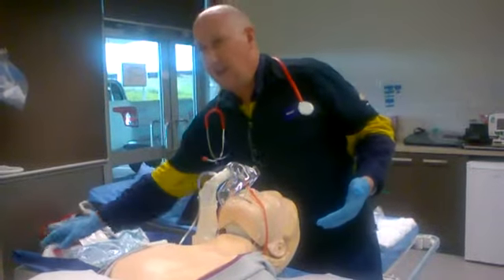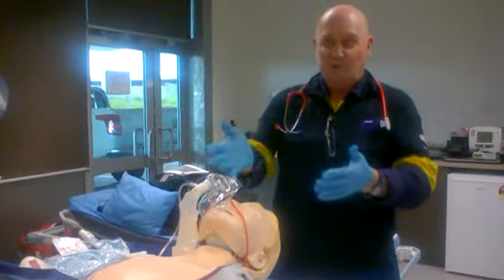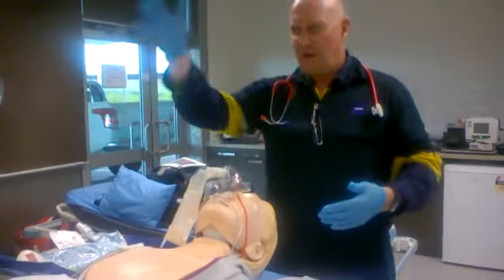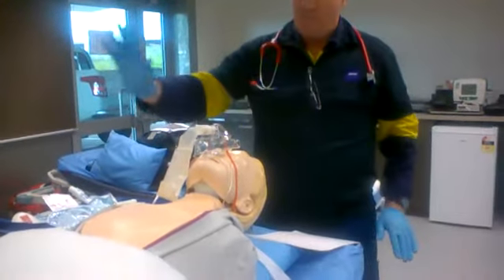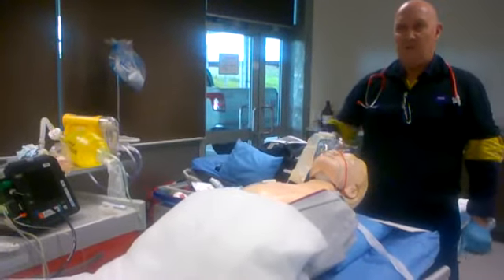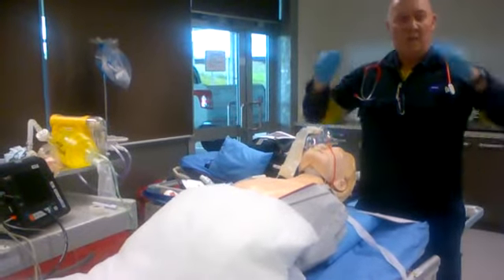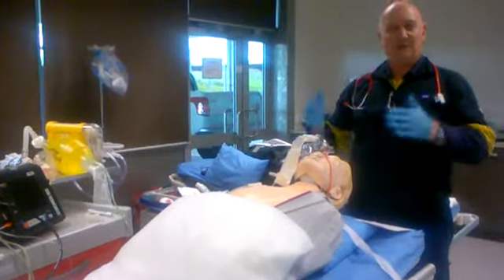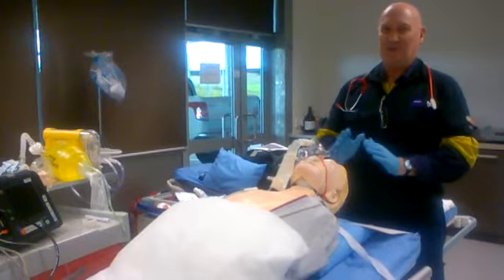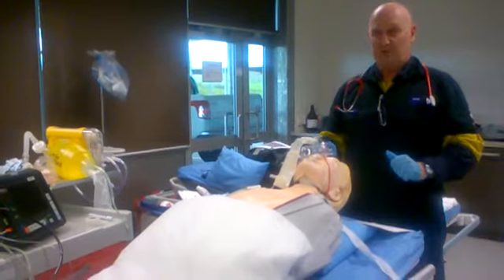So, in that type of pre-oxygenation, we oxygenate the patient with 15 litres of oxygen that we've got hooked up here by our non-rebreather mask and our nasal cannula. They have them monitored. Our IVs are on our left, while our monitors are on our right. We have BP cuff hooked up, we have IV, we have capnography as I explained by nasal, and we have our drugs for pre-treatment. We have designated team roles. And at the moment I'm by myself, and if you're by yourself, performing an RSI, don't do it. It's not a good idea to do it. You need help to set up and to monitor the patient.